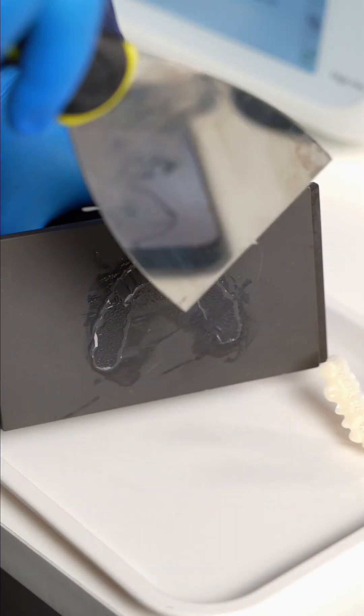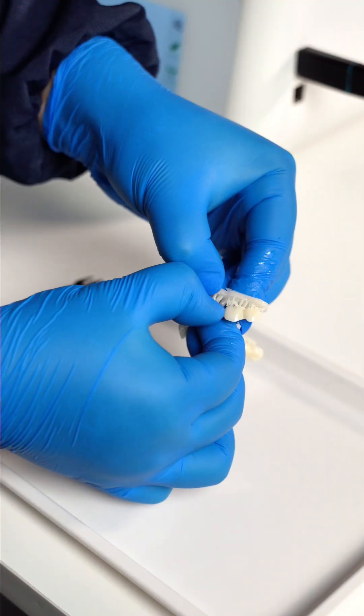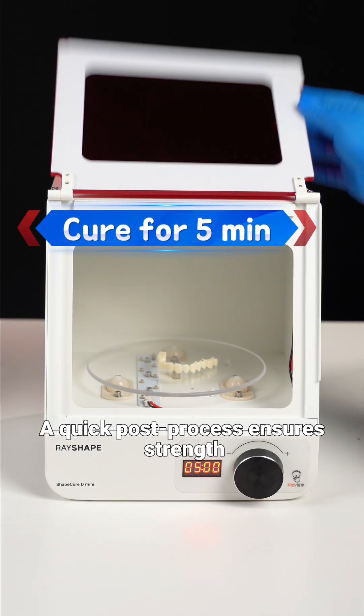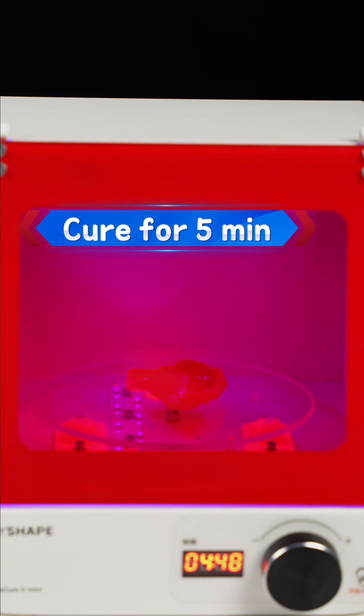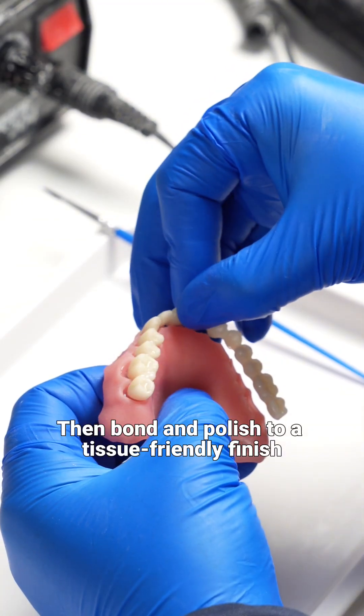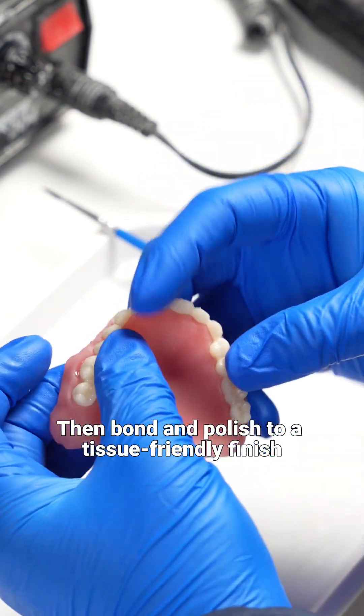Step 3: Cure and Assemble. A quick post-process ensures strength. Then bond and polish to a tissue-friendly finish.